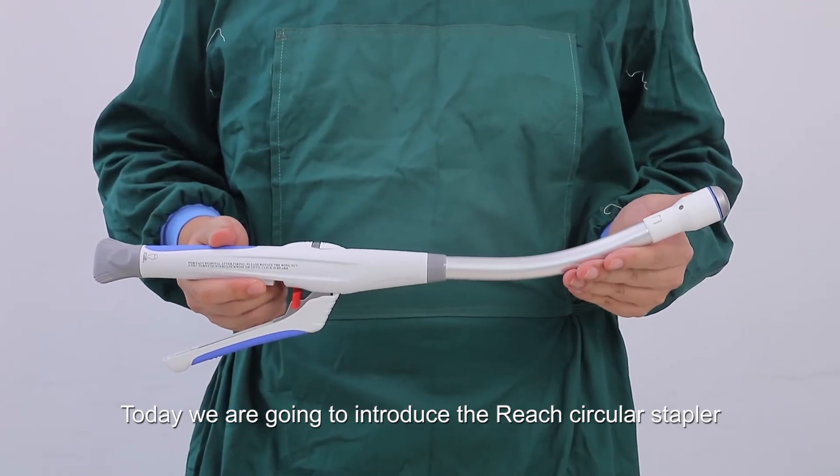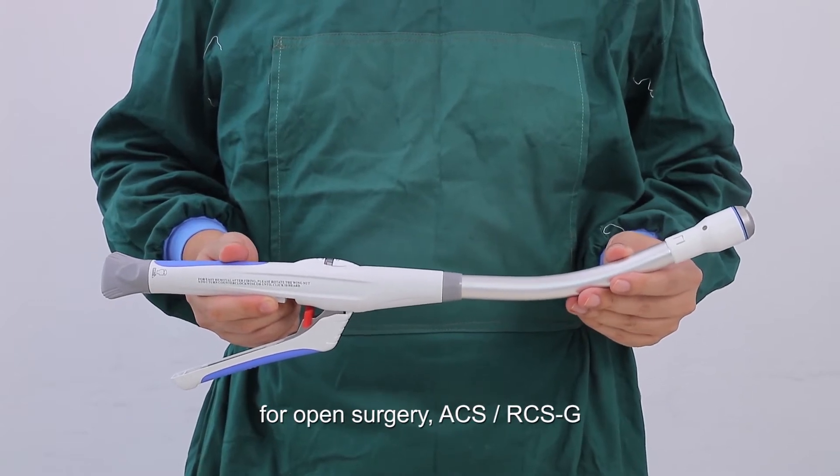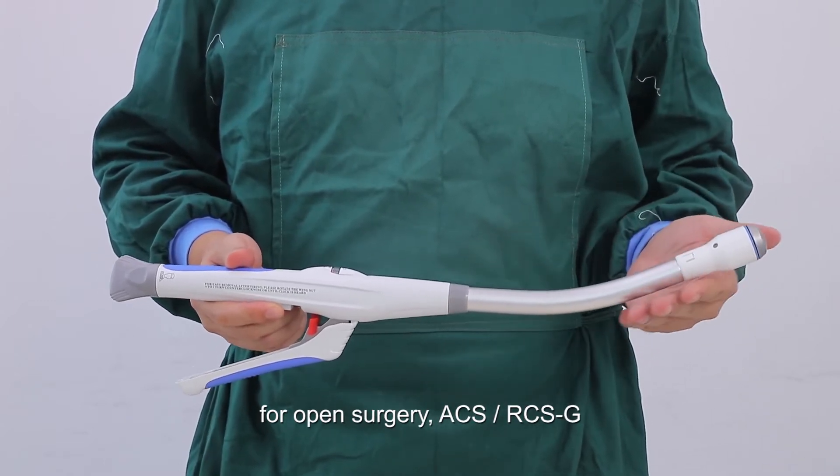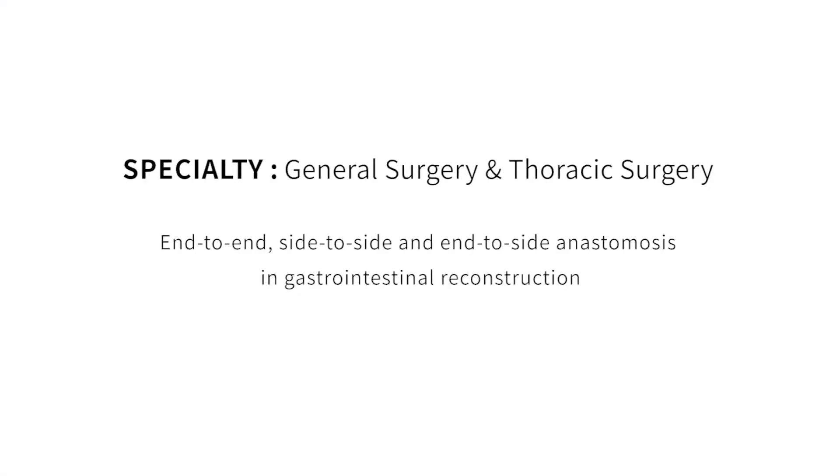Today we are going to introduce the Reach Circular Stapler for Open Surgery, ACS RCSG. Its specialties include General Surgery and Thoracic Surgery, supporting end-to-end, side-to-side, and end-to-side anastomosis in gastrointestinal reconstruction.